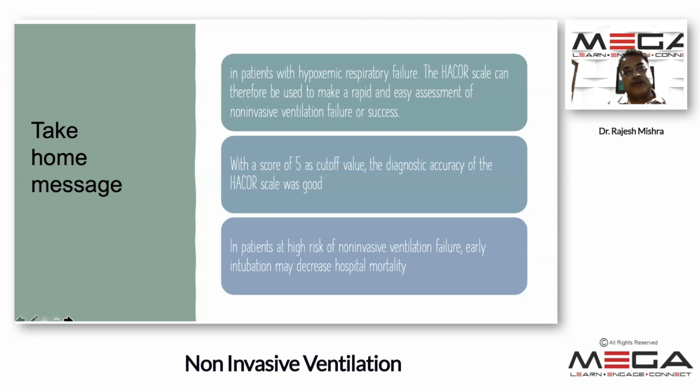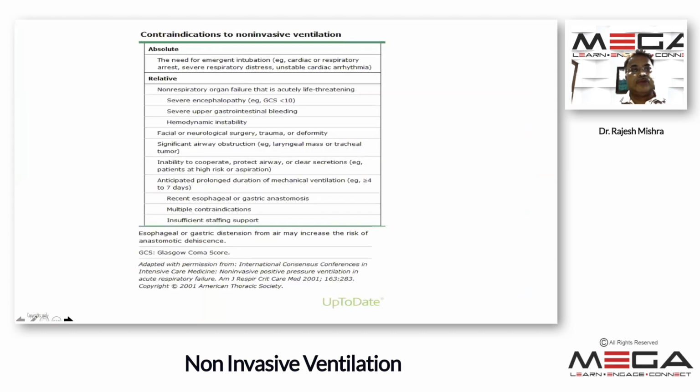So always, late intubation on NIV additionally causes lung injury, it takes away your physiological reserve and it causes more complications, and you have less chance of getting successful intubation if you put somebody on long-term NIV. So you have to be very, very careful about it.